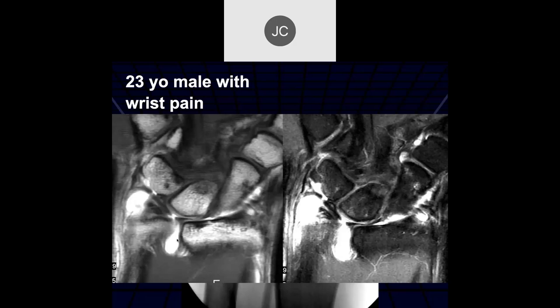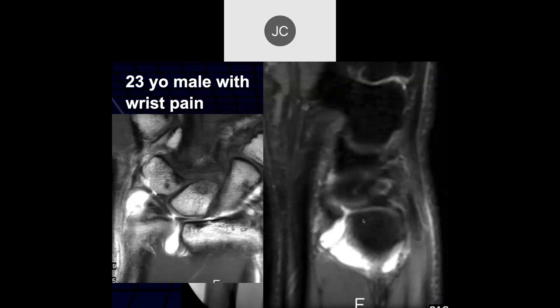This is in the coronal plane, and if we go to the sagittal plane, we can see the tear also in the sagittal plane.